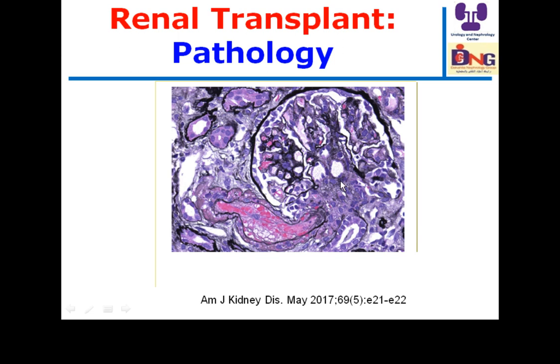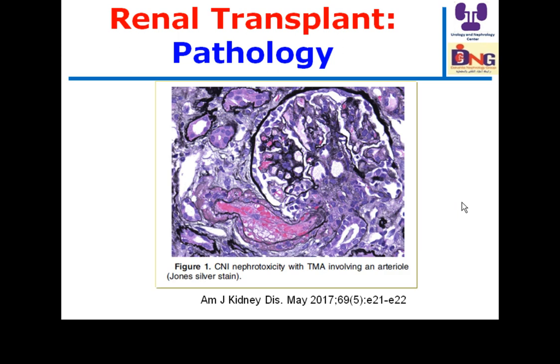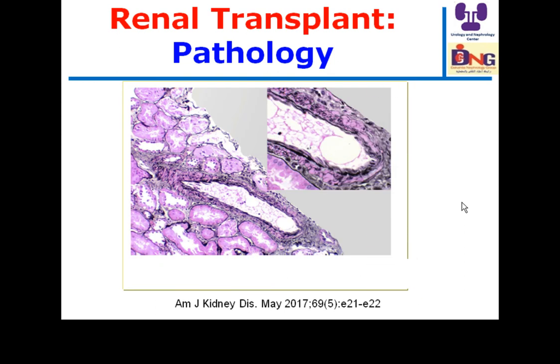This is a very nice slide, and it shows the presence of thrombotic microangiopathy. So this may be a manifestation of calcineurin inhibitor nephrotoxicity. To differentiate between calcineurin nephrotoxicity and acute antibody mediated rejection, because acute antibody mediated rejection may present with this pathological presentation, thrombotic microangiopathy, again we need to look at donor specific antibodies.